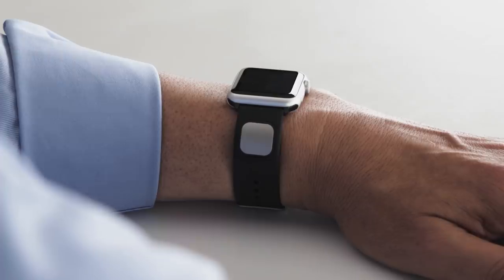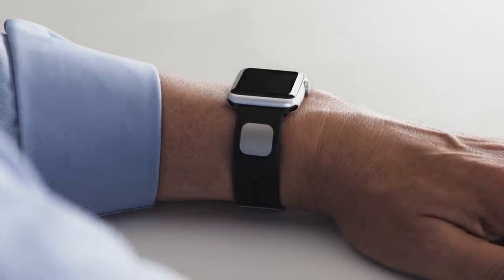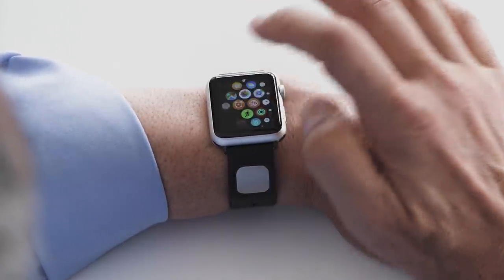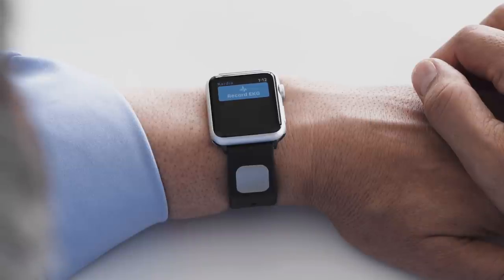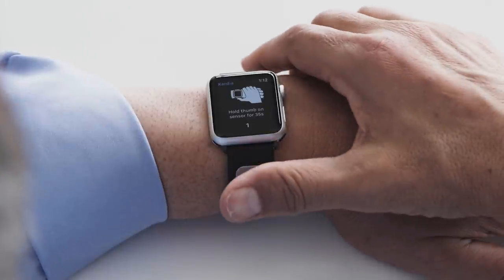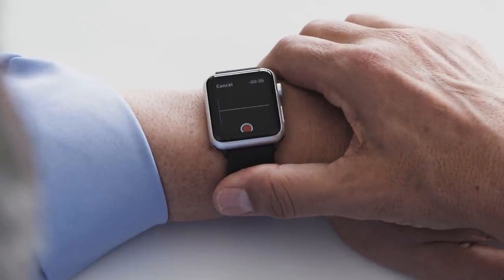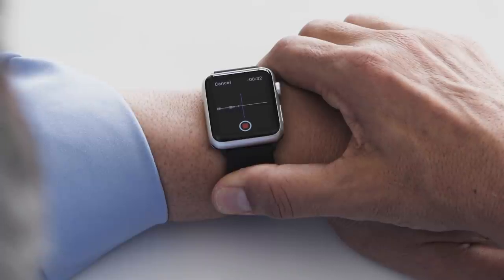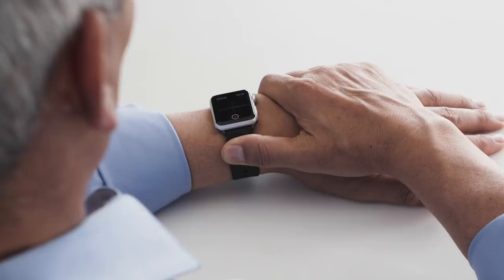Taking your ECG. CardioBand can be worn on either wrist. In this video, the Cardio user is wearing the Cardio Band on his left wrist. To take an ECG, tap the Cardio app on your Apple Watch. With the right hand, grasp your left hand. Rest your right thumb on the sensor. The inside of the sensor should be touching your wrist. Rest your hands on a table or your lap and remain still during the countdown to get an accurate recording.